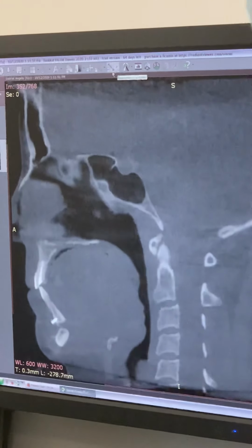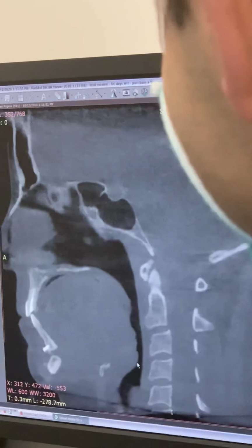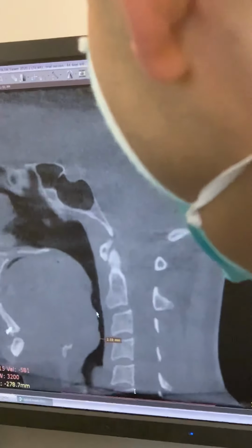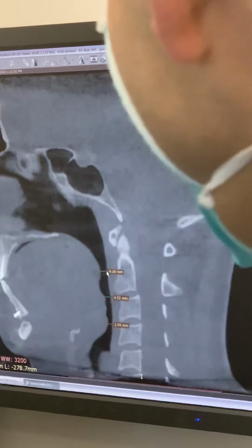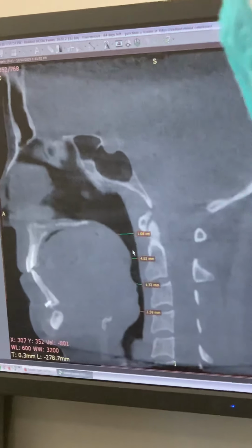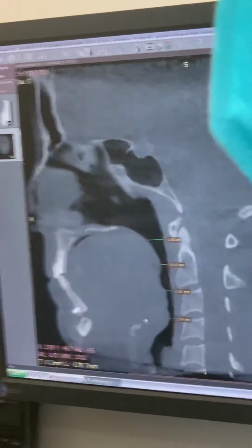So we measure this out, and here, right behind the mandible, your airway is 3 millimeters. Right here behind the tongue, your airway is 4 millimeters. Right here behind the soft palate, your airway is 5 millimeters, and then retromaxillary, it's not bad. This is kind of where it should be, 1 centimeter. It should be like that all the way down.